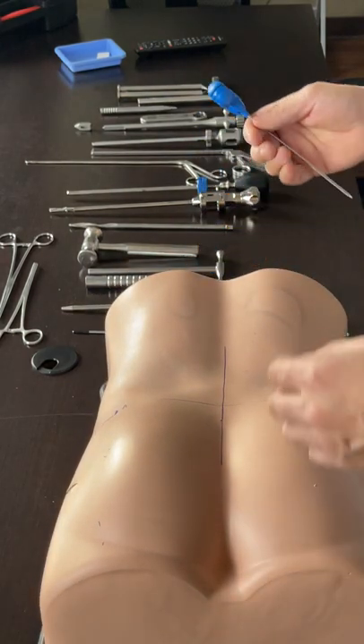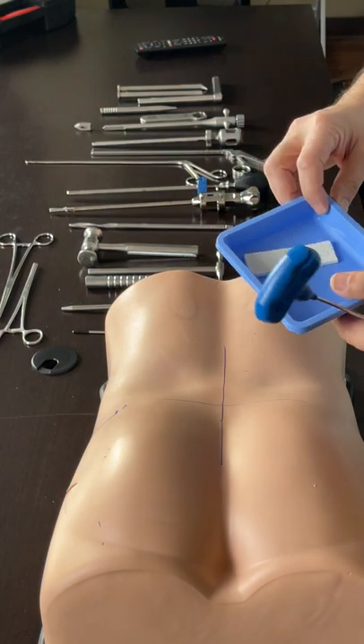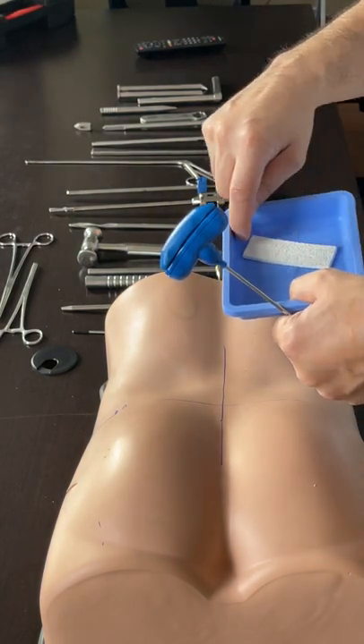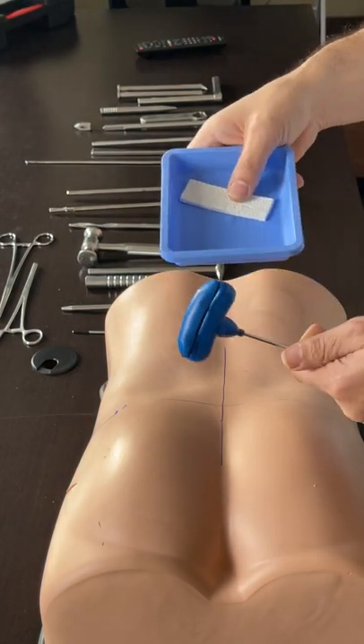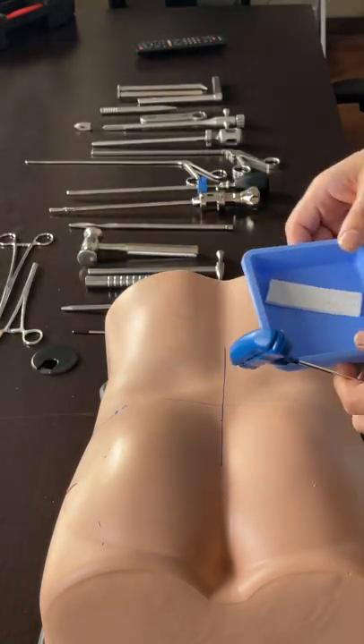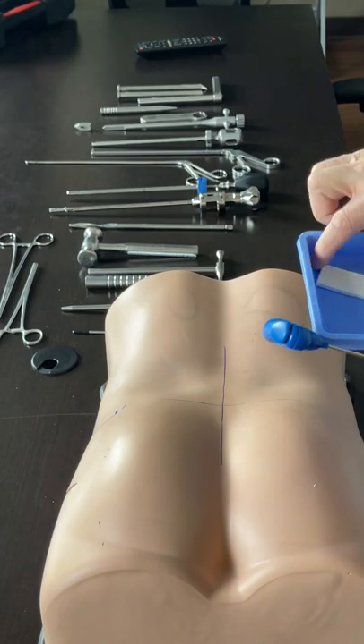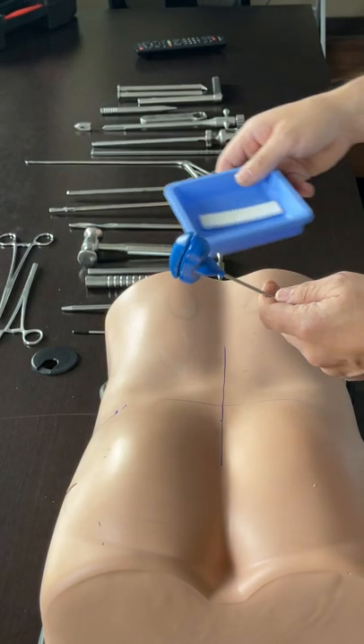I mix it with my tricalcium phosphate, which has the consistency that works the best. We cut it usually in strips - 4 strips out of this - and that enables us to soak it well. After 3 to 5 minutes, you get the best attachment of the material, and that is the best consistency to work with.